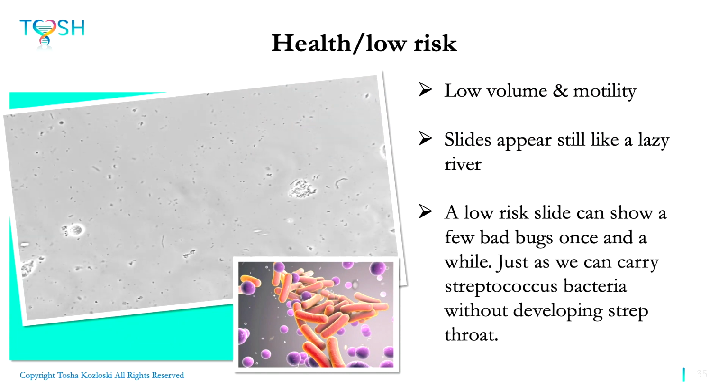So when we see a low risk slide or a healthy slide, it's going to have low volume, low motility. There's not going to be a whole lot going on. Sometimes the low risk slides look like a picture, not even like a live video. So they're kind of boring. It's great. We all want boring mouths like that.